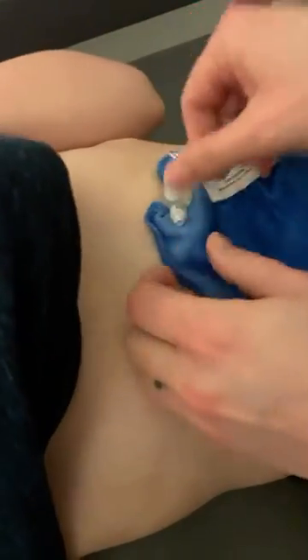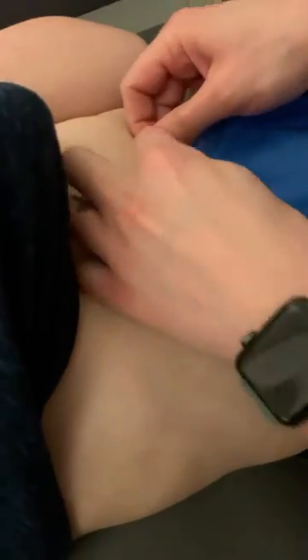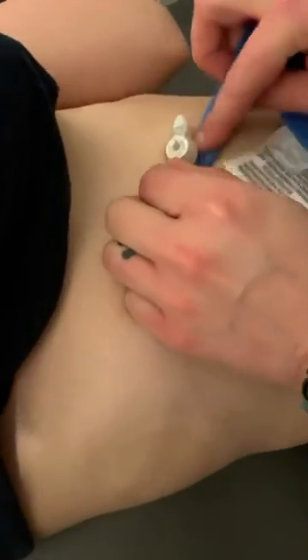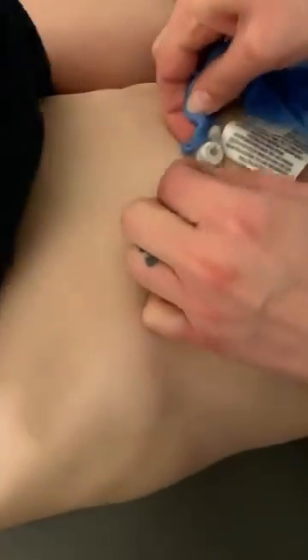So now I really have to make sure that it's dry because you don't want it to be wet against his skin. So that's why you've left part of the cloth dry. Just gonna twist it gently, make sure the underside of the Mickey is all dry and the site underneath is dry. And that's it.